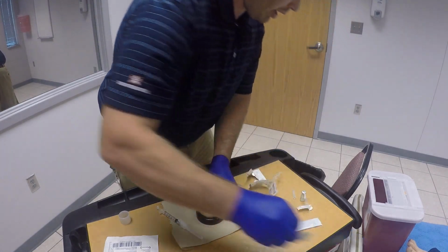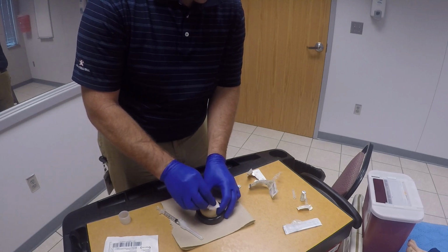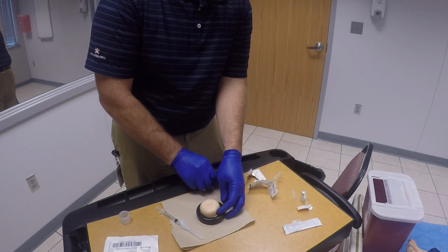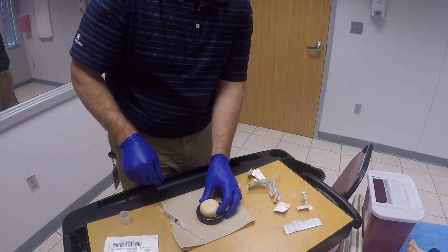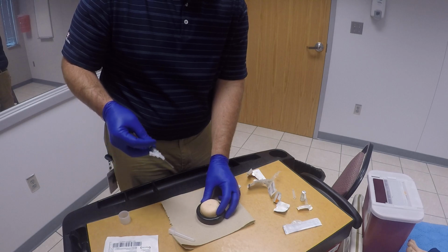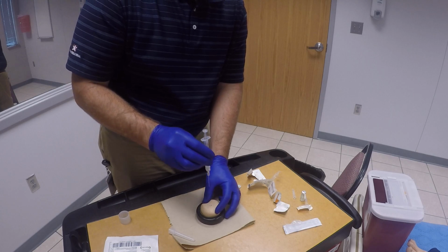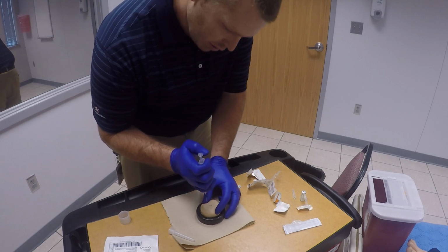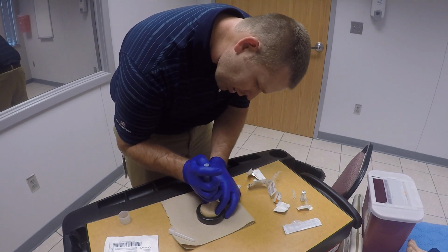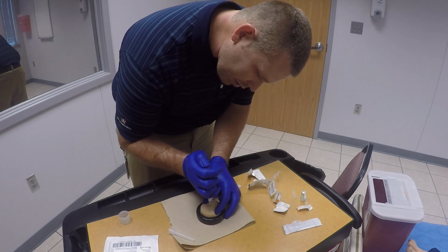Go ahead and get another alcohol pad out. And cleanse that site aseptically from the inside out. Alright, and since we're doing IM, we're going to stretch the skin just a little bit like I said, and we're going to insert at a 90-degree angle. Insert it in. Go ahead and aspirate, make sure you don't have any blood return. Checking your syringe, and then you're going to administer that drug.